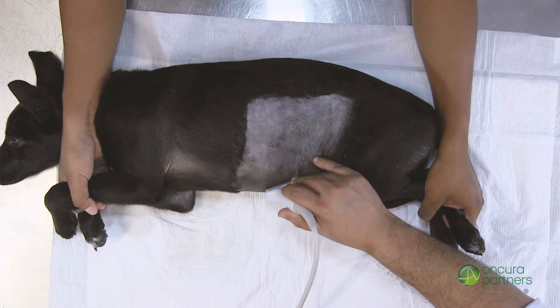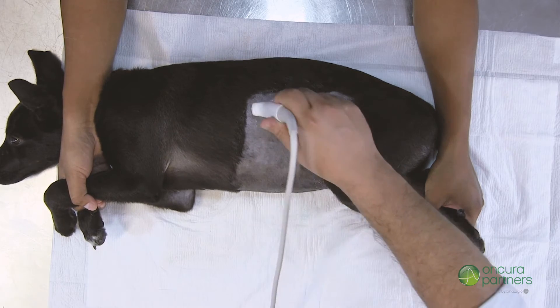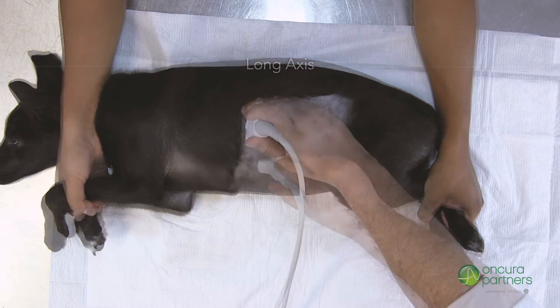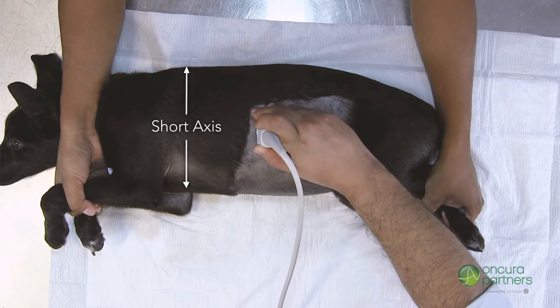Please note that due to the orientation of the stomach, transverse images of the stomach are obtained by placing the transducer in the patient's long axis. The opposite is also true — if the transducer is placed in the patient's short axis, long axis images will be acquired.